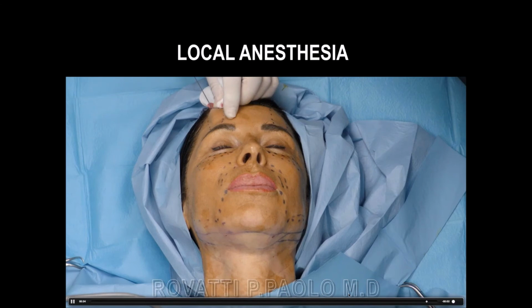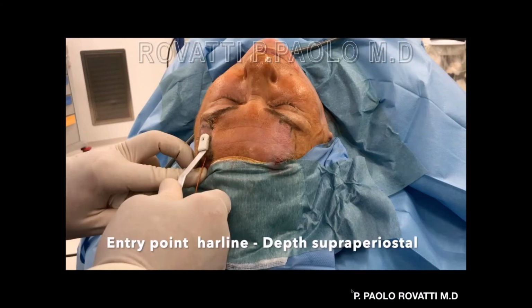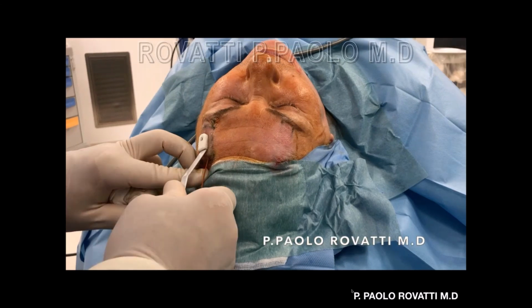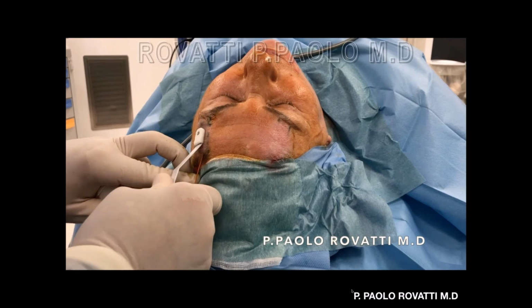Remember, all these videos you will see on the YouTube channel afterwards, if you want. And I wrote some things that you must follow from the hairline. Stop there. Don't go to the eyebrow, but stop before, because we have a 1 centimeter dangerous area. Stop here. Look, and I'm treating this area. This is the only area where I go. No 2 planes, only 1 plane, only below the muscles, on the supraperiosteal, above the periosteal space.